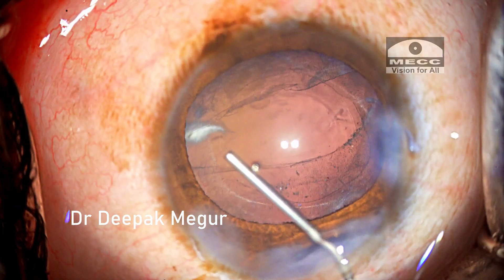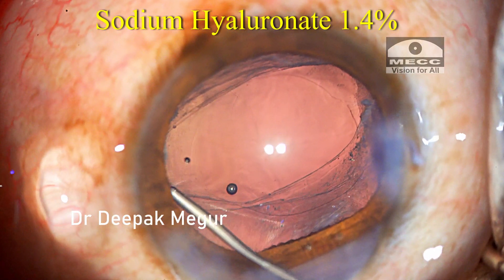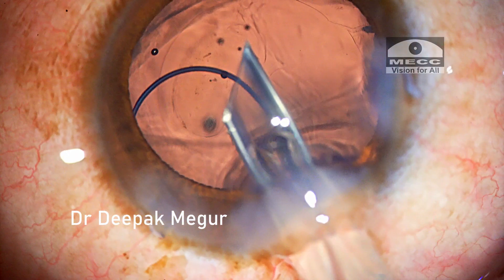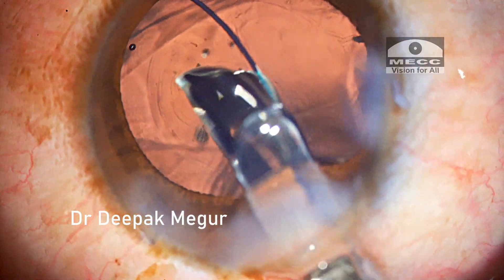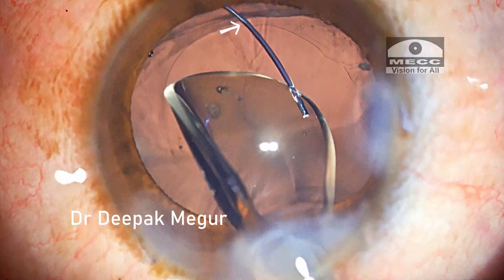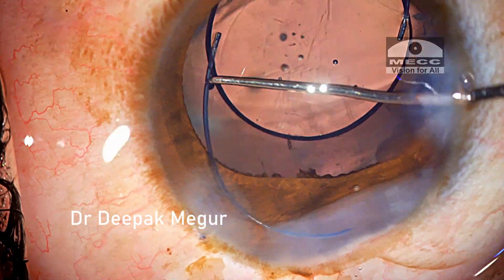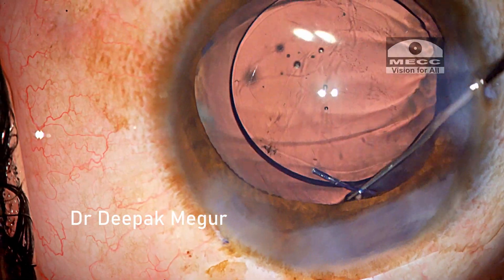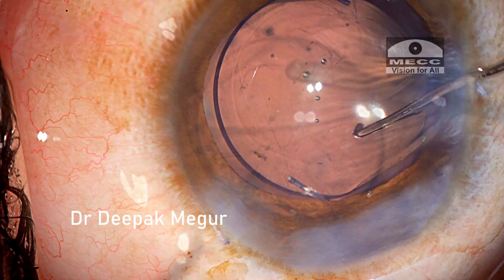It is time to implant the lens now. I am creating a space under the iris and above the anterior capsule with the help of sodium hyaluronate. I intend to place a multi-piece lens with the haptics in the sulcus and the optic captured in the rhexis. The distal haptic is gently dropped into the sulcus over the anterior capsule, and the other haptic is then dialed in so that the entire lens with haptics is placed in the sulcus above the anterior capsule.